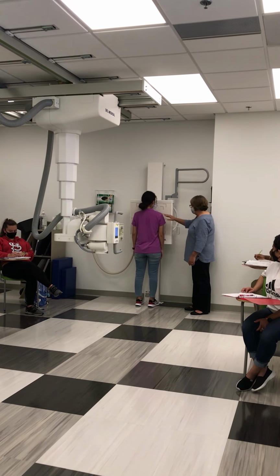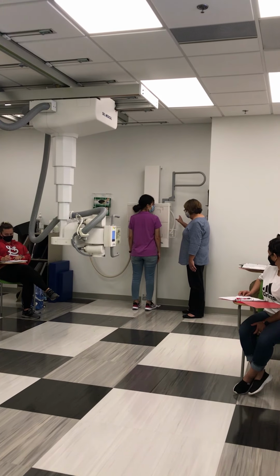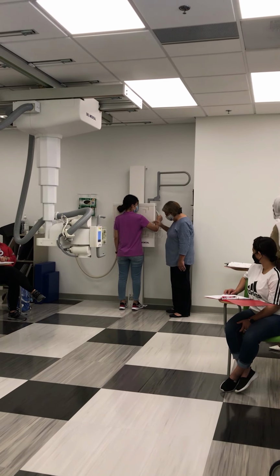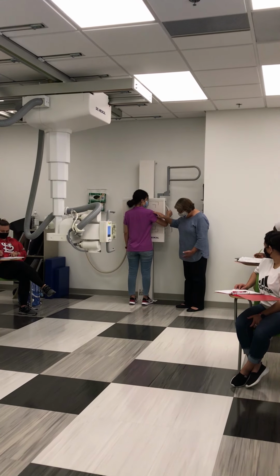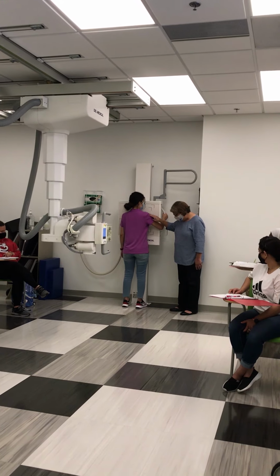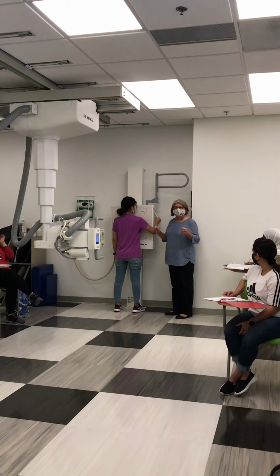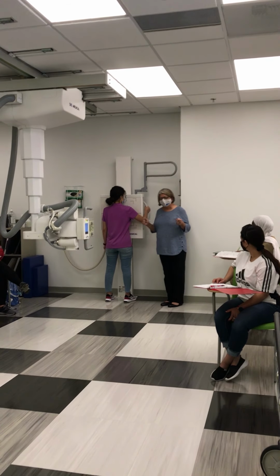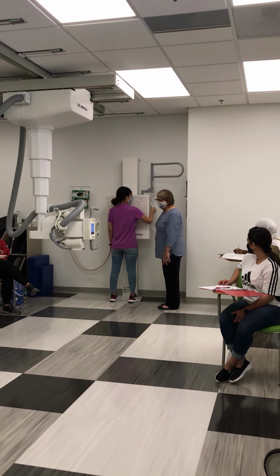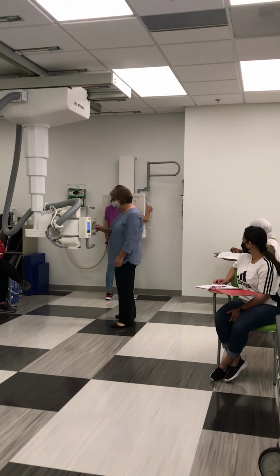Great. And now I want you to reach forward with your hands and grab the bar that's in front of you. I want you to stand with your feet separated, shoulder width apart, a little bit farther. And that's to provide stability for your patient, because you want to reduce the possibility that they're going to wobble. And with my patient in place here, now I'm going to center.